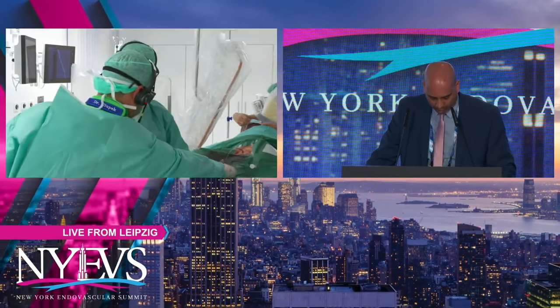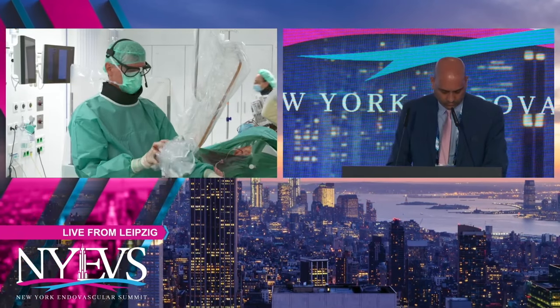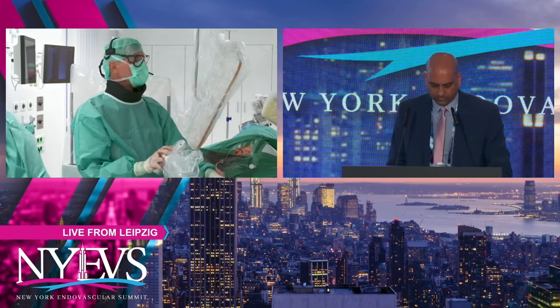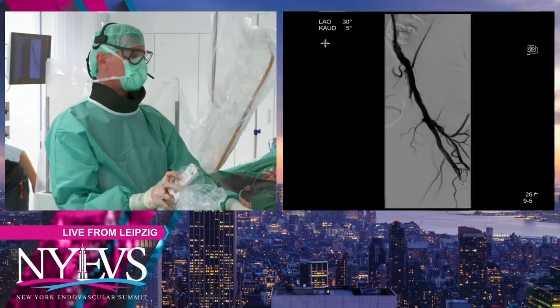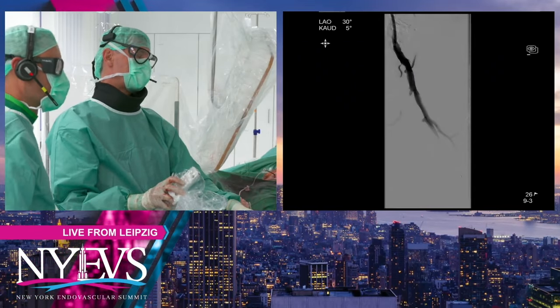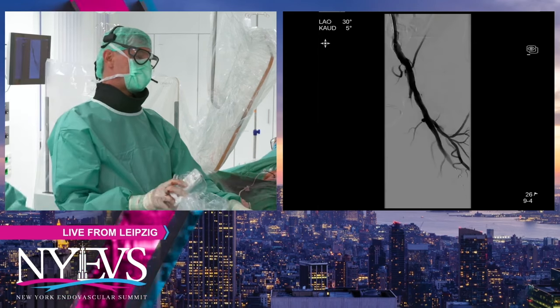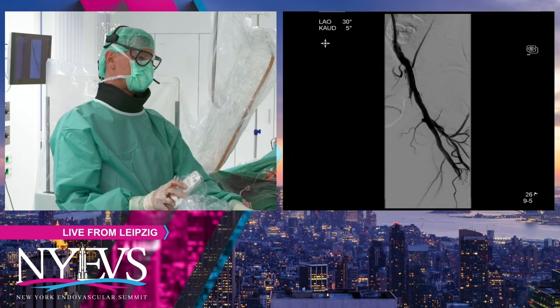We're actually quite far. So we did, once again, treatment with a Magic Touch in the common femoral artery, and currently that is the result. I think there's maybe a little bit of bleeding into the plaque in the common femoral, but especially the profunda artery looks very nice.